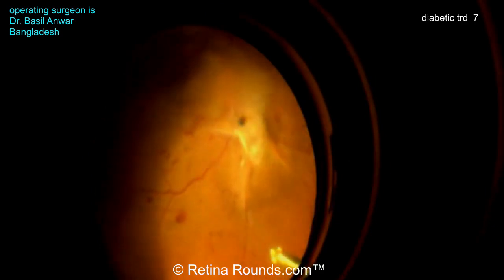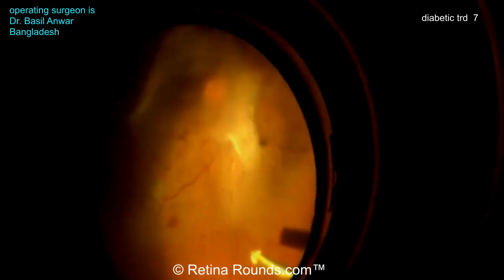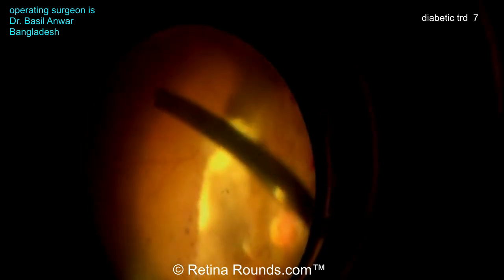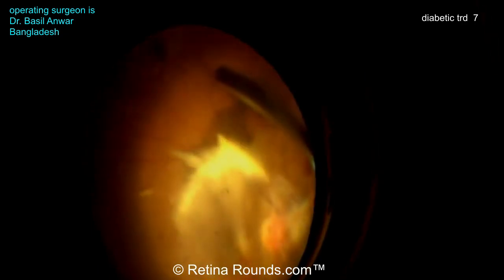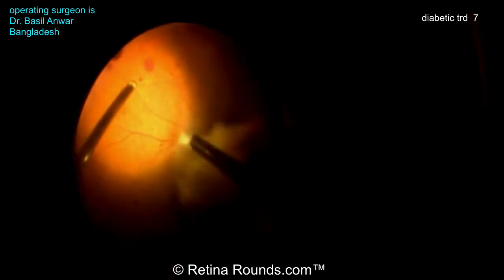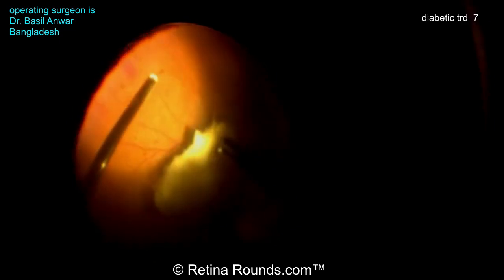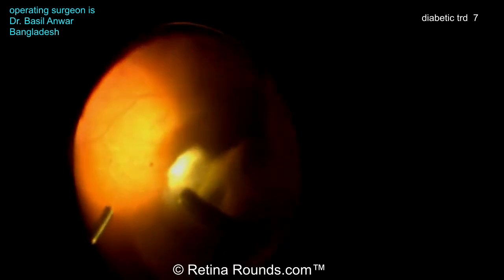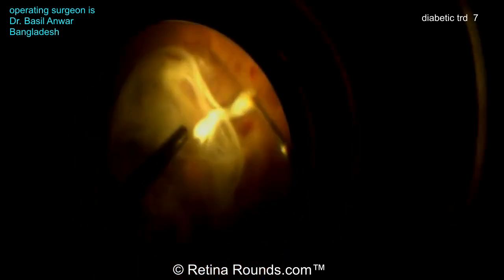Now Dr. Anwar is doing a very important first step, which is to segment the vitreous — the vitreous adhesions to that posterior membrane near the optic nerve from the anterior vitreous. He's going around 360 degrees and segmenting that, which is important for two reasons. One, when working posteriorly, you don't want to be exerting any traction anteriorly. Two, it can help identify planes better. In fact, many times there can be a partial PVD, and this process can help propagate that PVD to make sure you're in the proper plane.